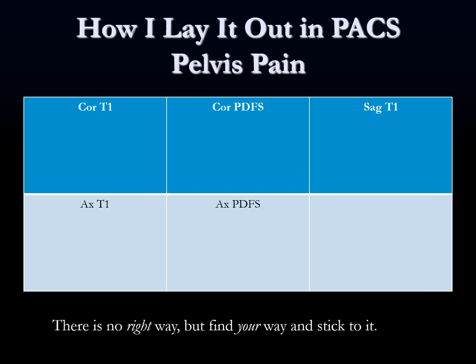There's no right way to lay out the exam, but I suggest figuring out which way you like and doing it the same every single time. I do coronal T1 and PD fat sat, then axial T1 and PD fat sat across the top and bottom, with the sagittal T1 on the upper right - everything triangulated so I can look at anatomy in multiple planes.